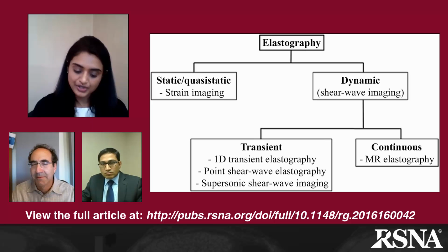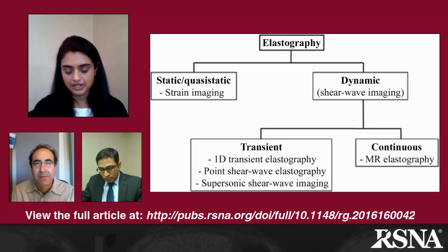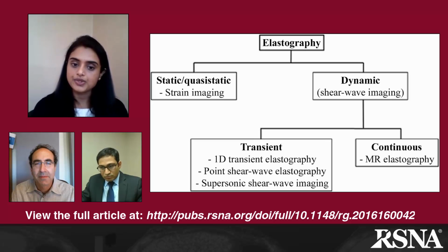Finally, MR elastography uses continuous vibration to produce shear waves. A special motion encoded GRE sequence helps determine the degree of fibrosis in these patients. And going forwards, I think that will be the main modality used for assessment of elastography.